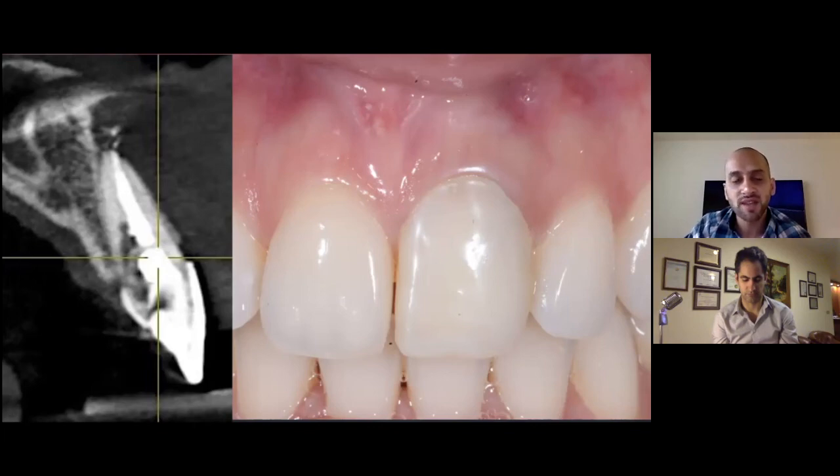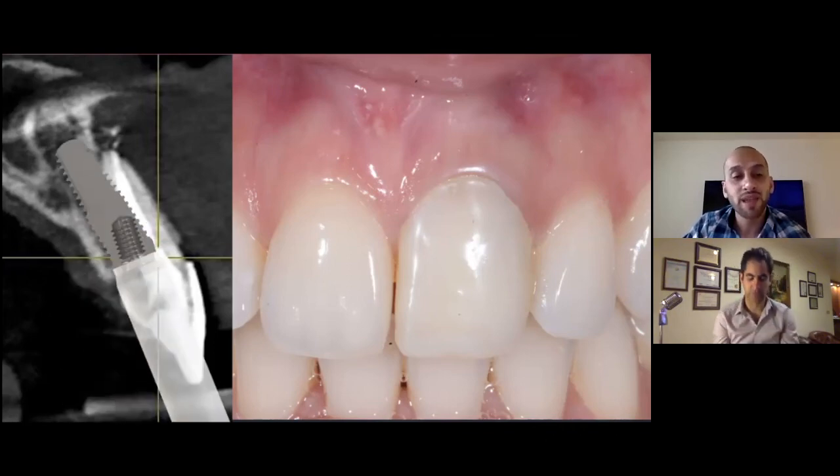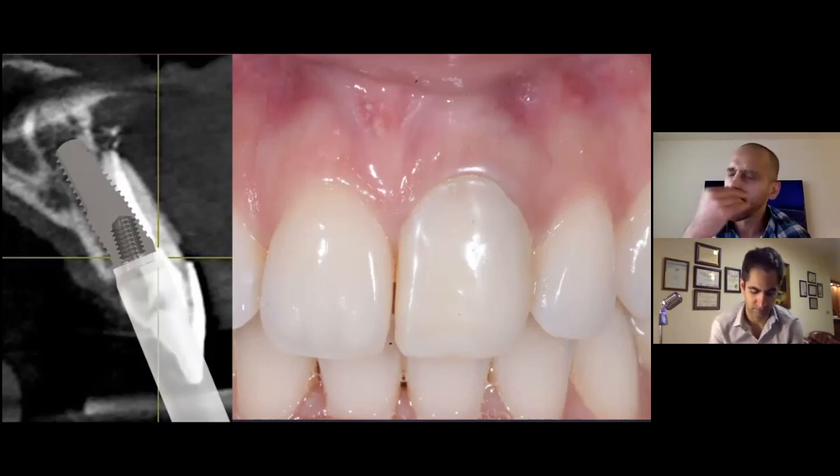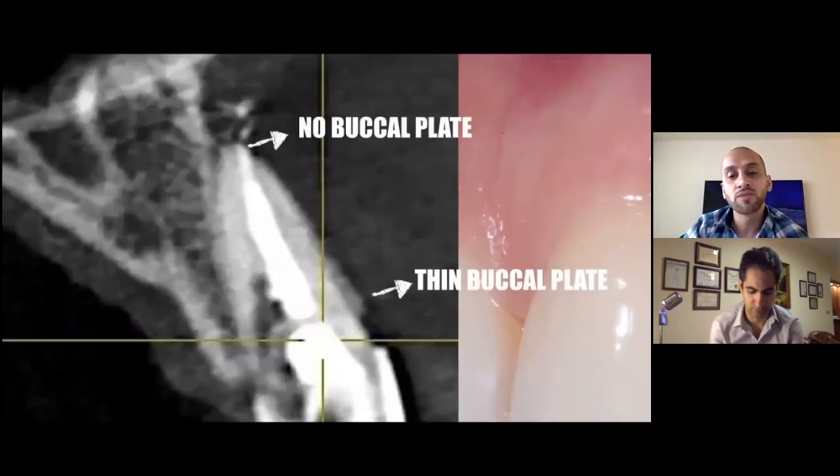So this case is actually, I like it a lot because it summarizes everything that I have talked about in this presentation. So an implant is placed, a coaxis implant. The apex of the implant provides the primary stability that we want by engaging the palatal bone. The abutment that goes on top of that is a zirconia abutment that we talked about on an external hex implant. But the most important thing to realize is that the thin buccal bone that's still present right next to the gingival margin, that bone must be preserved.